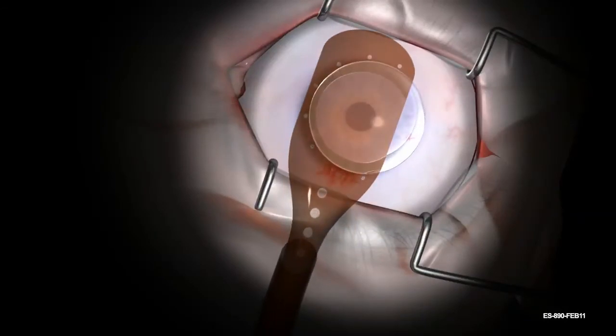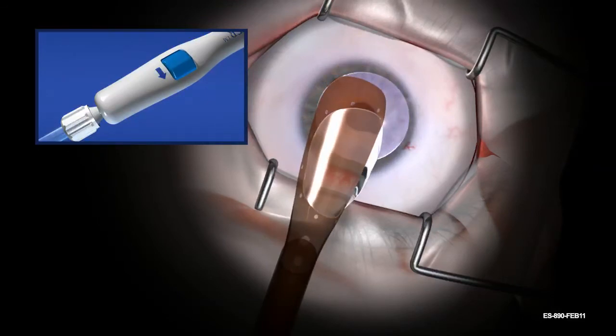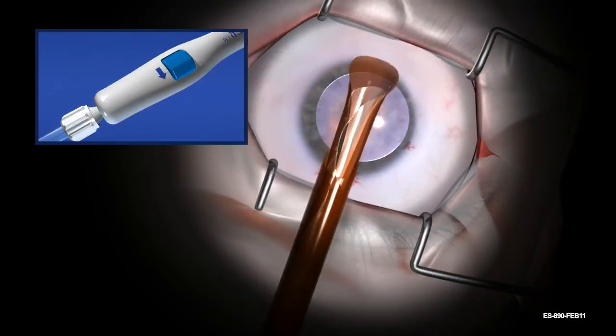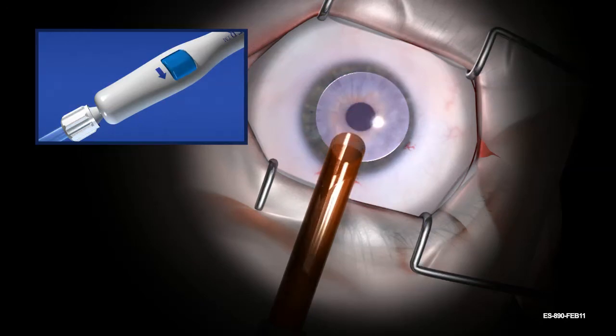Once tissue is properly positioned on the carrier, rotate the blue thumbscrew in the direction of the arrow. As the tissue retracts and begins to roll, gently tuck the overhanging tissue under the opposite edge. Visualize the tissue loading until complete, and if necessary, repeat tucking the exposed edge. Allografts that do not overhang the carrier will not require tucking.